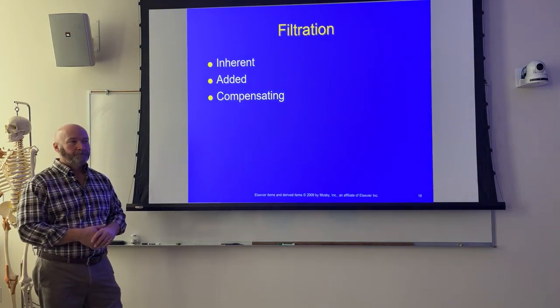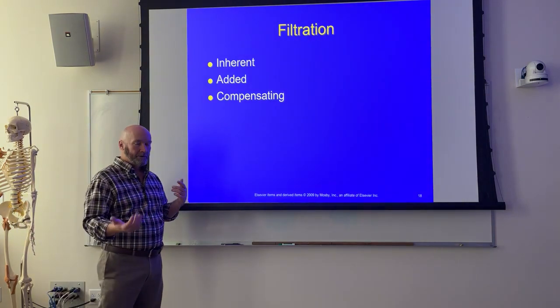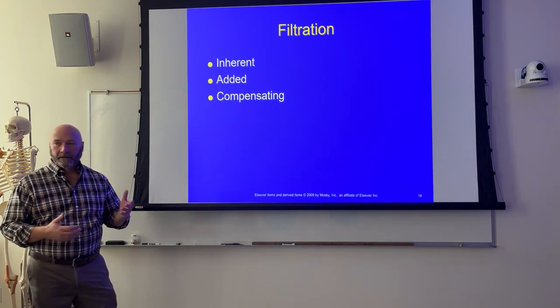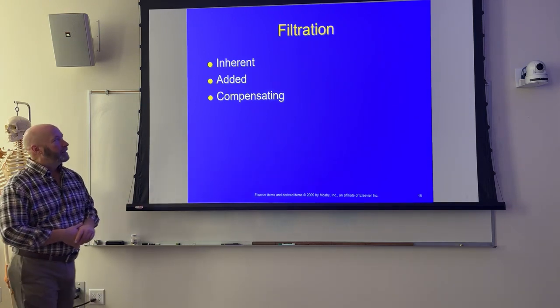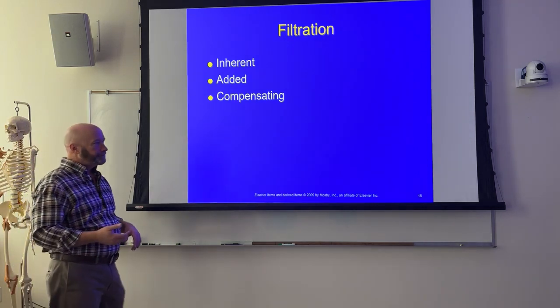I can see that. Mammo tubes are going to use all different kinds of filtration to make the beam more homogeneous, remove some of the photons just going to absorb inside the patient's body. Okay? So anything above that 2.5 is added filtration.